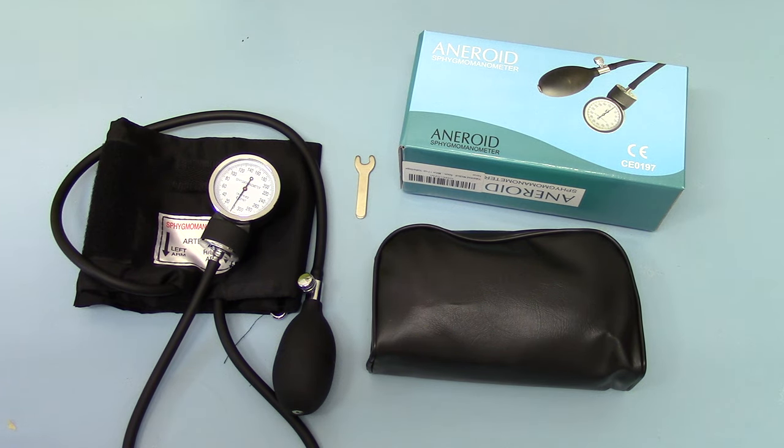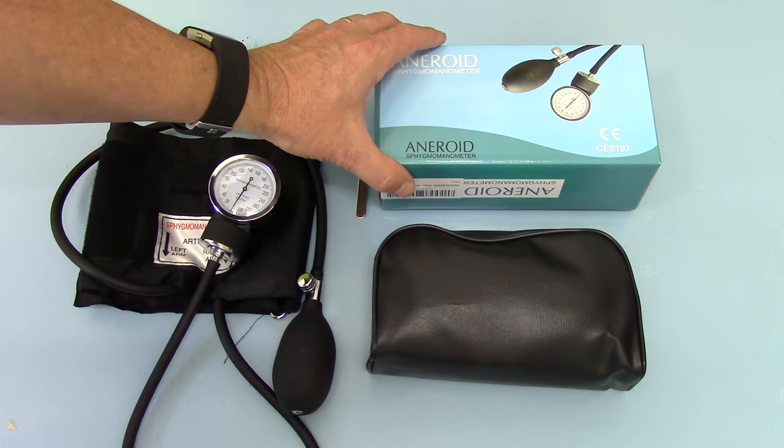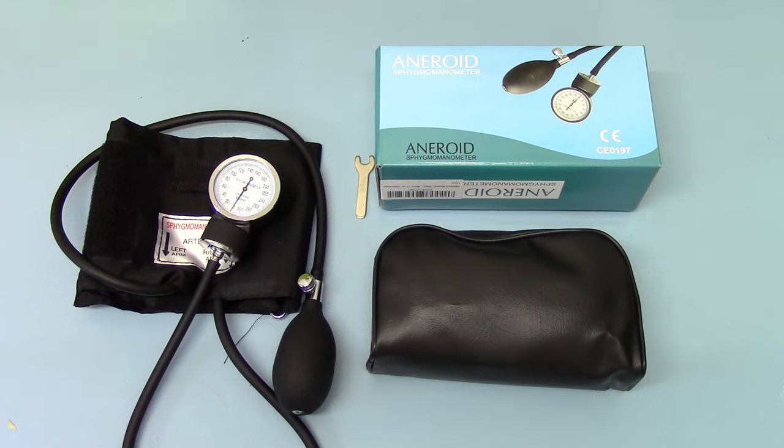That is not a formal calibration. If you read the instructions, it does talk in terms of getting these units calibrated periodically. But to be honest, due to the low cost of these units — we're looking between $13.99 and $14.99 as a retail delivered price — it is probably cheaper to replace these units every two to three years rather than sending them for calibration, which is going to be considerably more expensive. So that is the Valumed Aneroid Sphygmomanometer and Stethoscope Pack, ideal for anybody wanting to take blood pressures in a clinical setting.